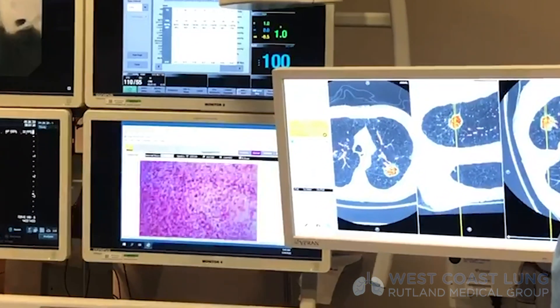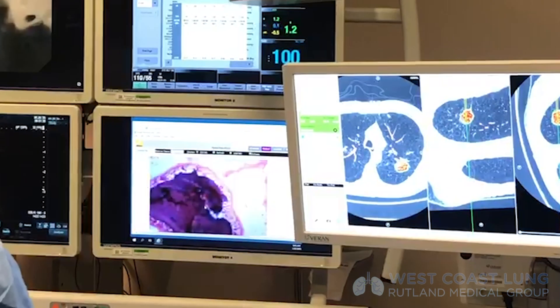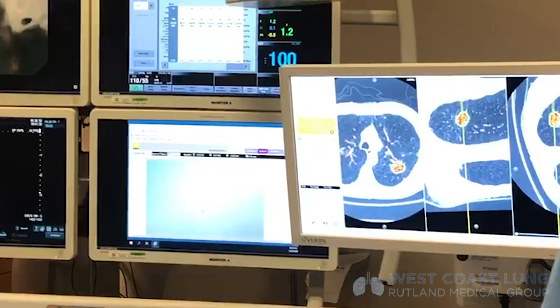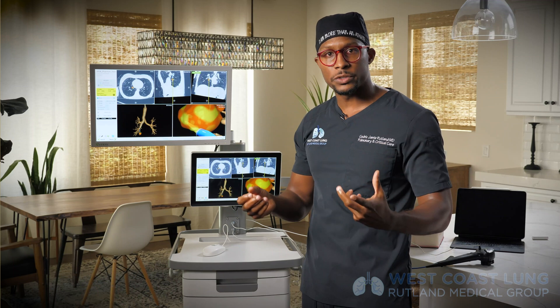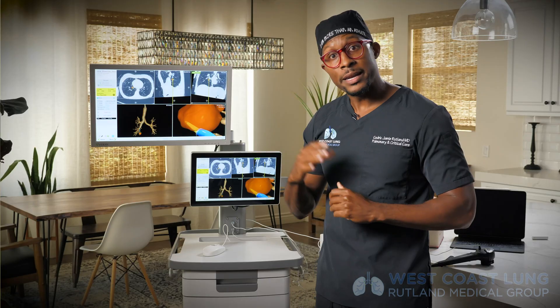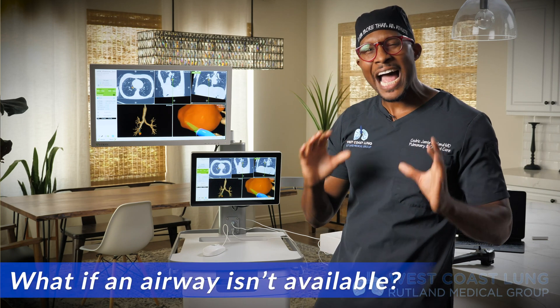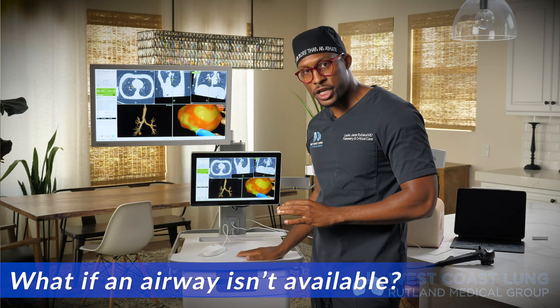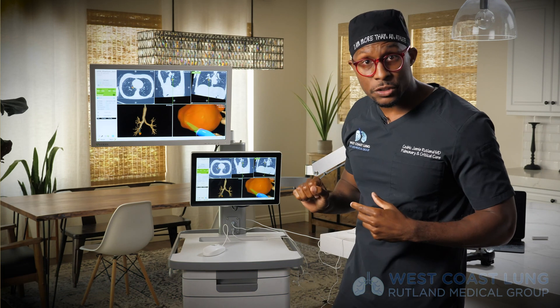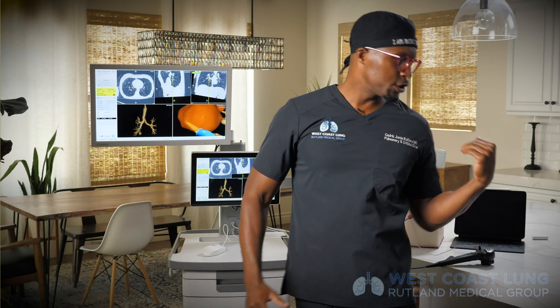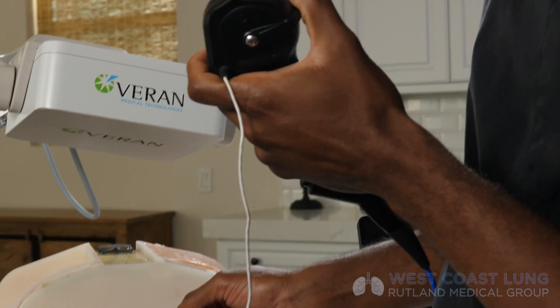Once you biopsy the lesion, you want your pathologist next to you so you can see if you have enough tissue to make a diagnosis — it's not a rule, but it's definitely beneficial. Here's what I love most about this machine and Veran in general: this is a navigational system. I can go through the bronchioles, through those airways, and get guided to the lesion. It's like a joystick — guide yourself right there.